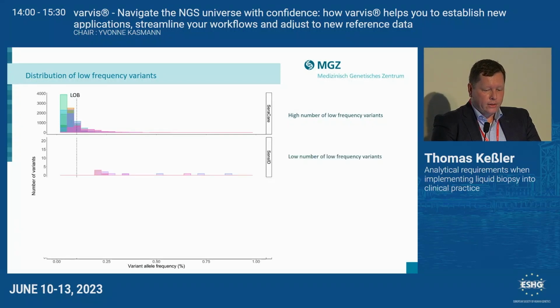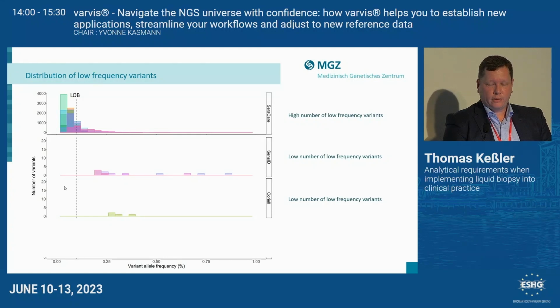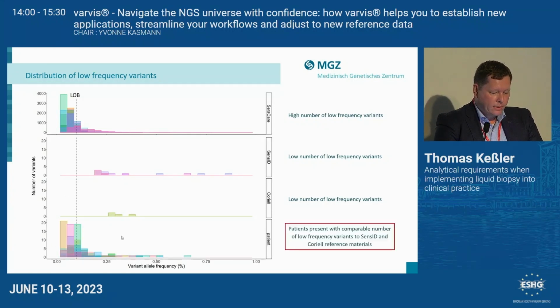And if you compare this to the other two materials that we tested, there is much less noise at the lower end. And actually, this lower bar here is what you see in actual patients. So the patients present with a comparable number of low frequency variants.